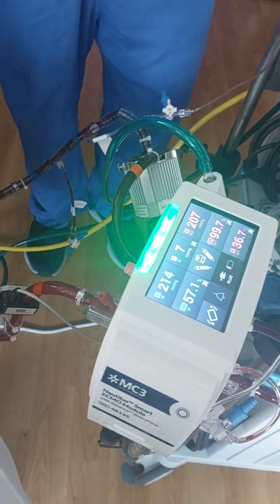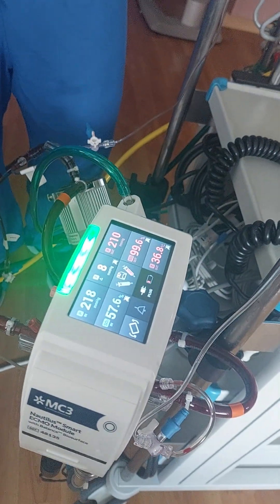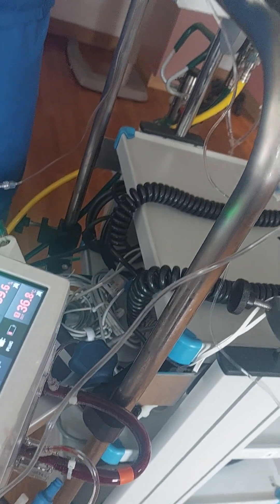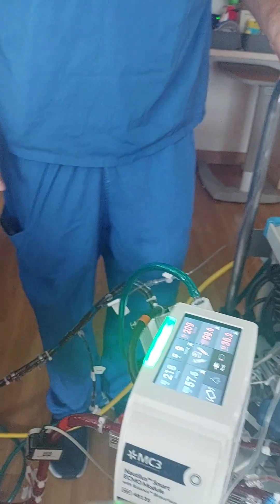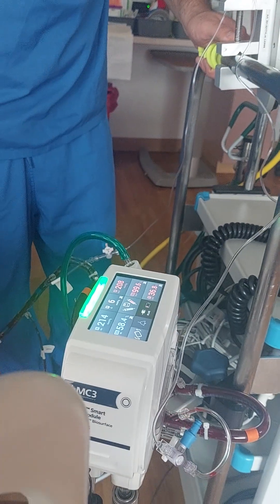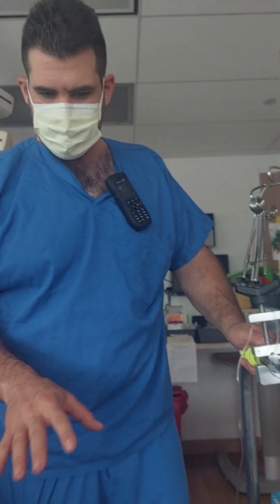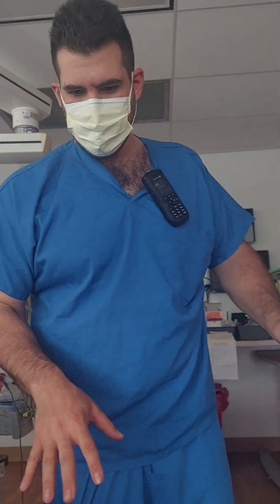I'm going to be talking about the physiology of how the circuit works. She's going to audio record me while I'm talking about it, but there won't be any data — this is just for her learning purposes, as long as you're okay with that. So this particular type of ECMO support — this is VA ECMO, so veno-arterial ECMO.